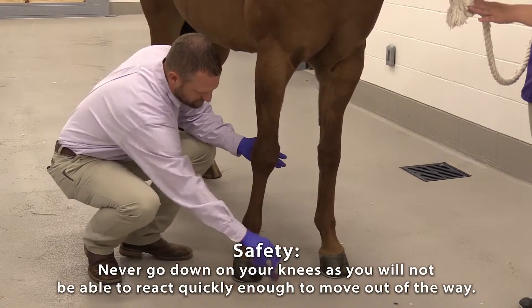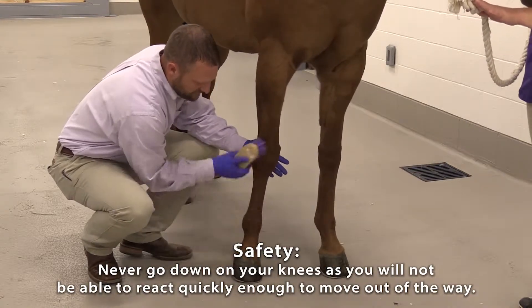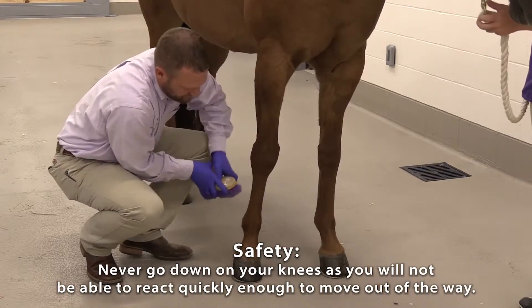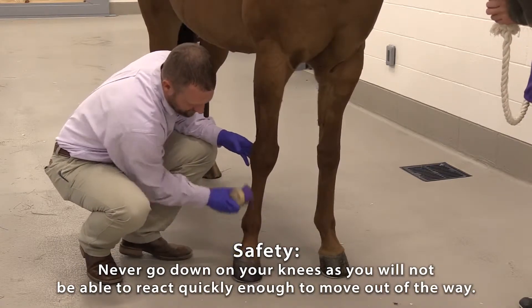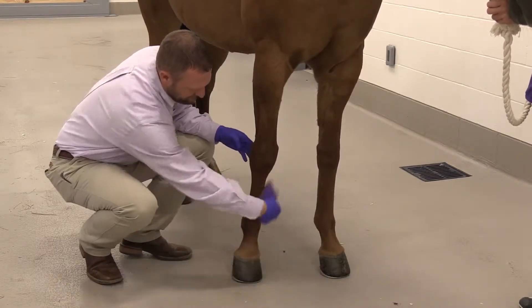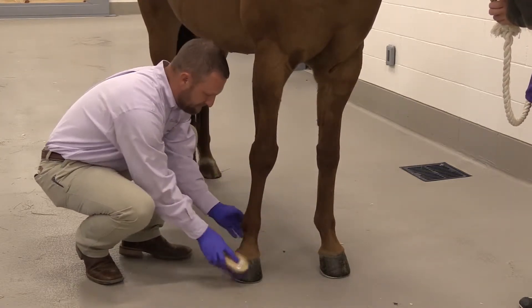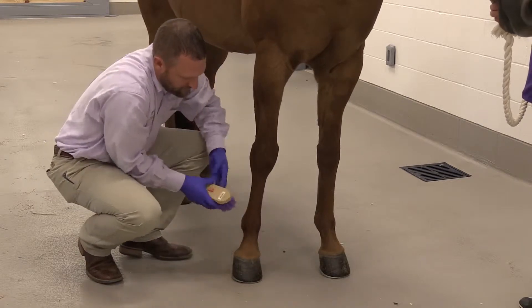The reasons to use reusable material — which should always be prescribed by your veterinarian and consulted prior to use — is that with multiple bandagings, reusable material can help with potential cost.